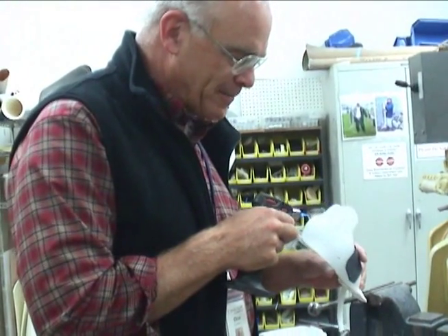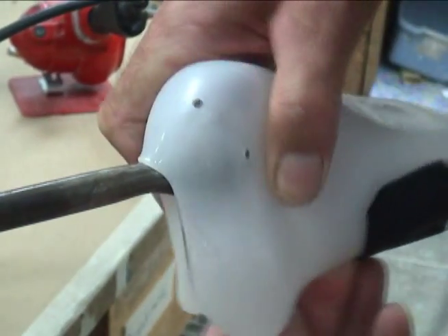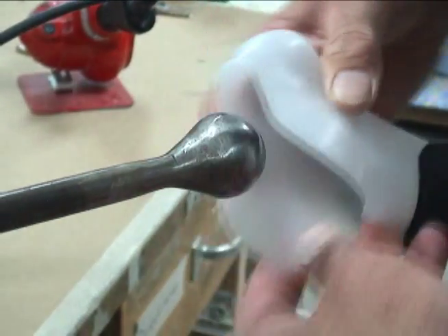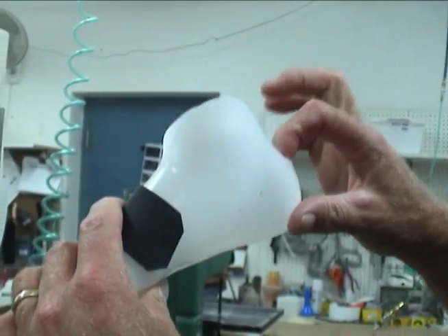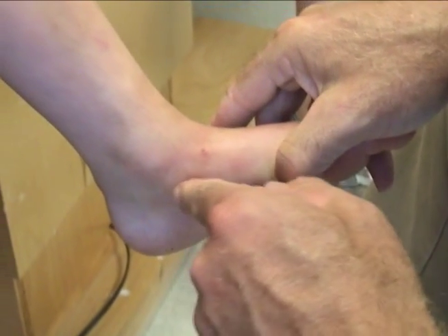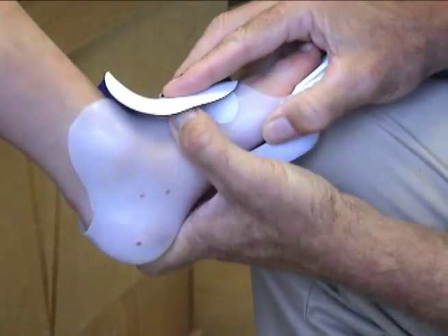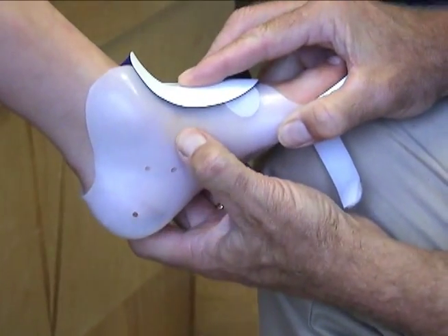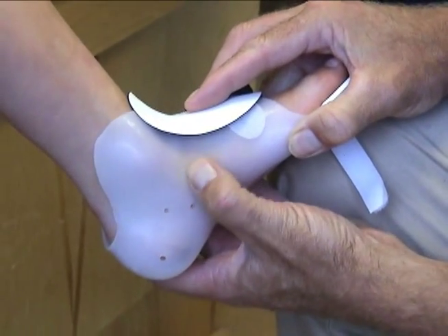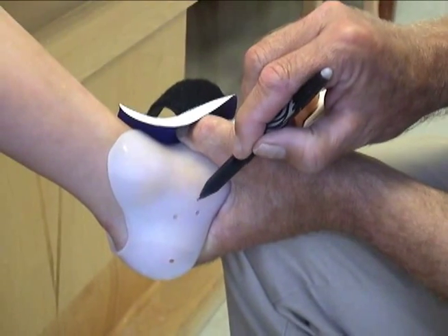You will also notice in this video that I'm flaring the back of the heel area slightly. It was noticed at the time of initial fitting that the trim line might be a little aggressive in this area. Upon further walking, Austin reported that he was feeling some discomfort in his navicular areas. Austin's naviculars are quite prominent, even when his foot is corrected, so it's not surprising that in the brace he needs a more specific contour.